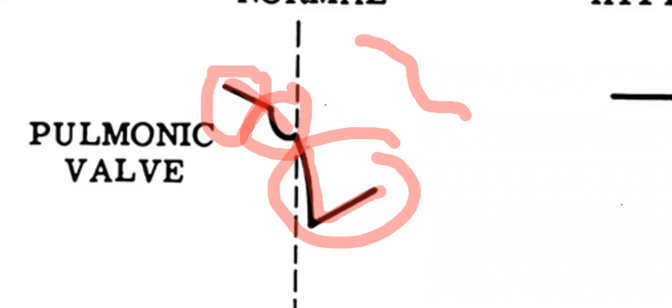Why this atrial dip? Because diastole has two stages, the initial flow and the atrial contraction. The pulmonary valve is so pliable. When the RV fills with blood during the initial flow, the RVOT will be full of blood. When the atrial contraction comes, the flow in the RVOT gets higher, to the extent that it creates some bulge in the pulmonary valve while it's still closed. It's still closed, but it's bulging forward. That bulge forward prior to its opening is due to the atrial contraction.